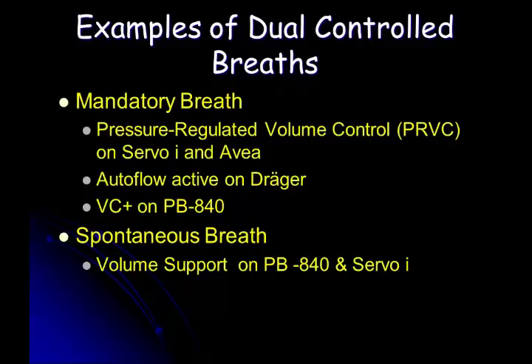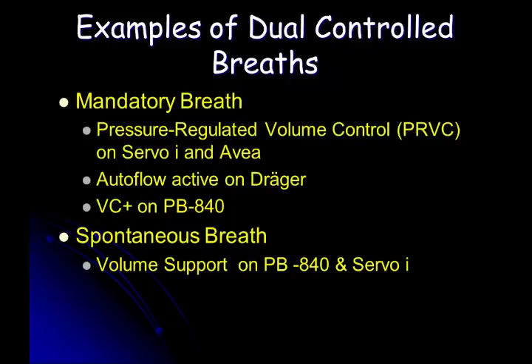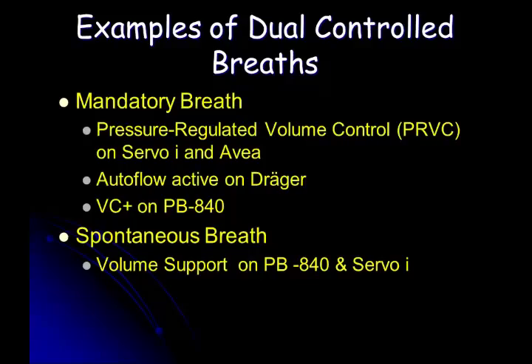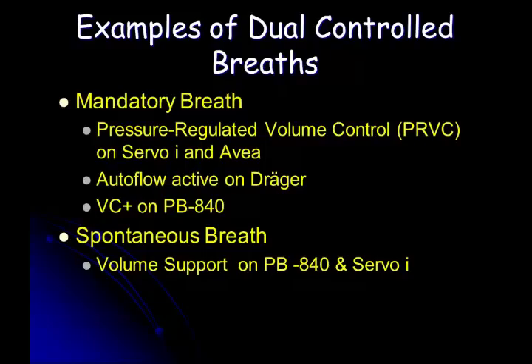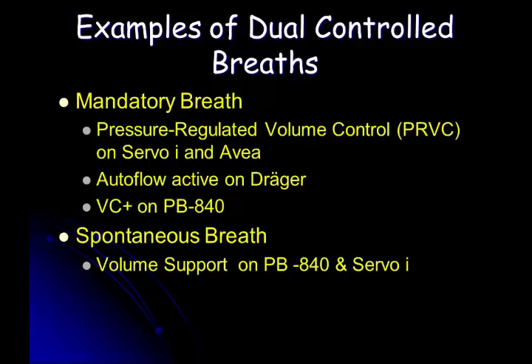I can do this same thing where I'm targeting a tidal volume on a spontaneous breath by adjusting the pressure support level, up or down. So let's say I have somebody who's totally in a spontaneous mode. They're breathing totally on their own. Ventilator's just there kind of monitoring their volumes and seeing if they go apneic.